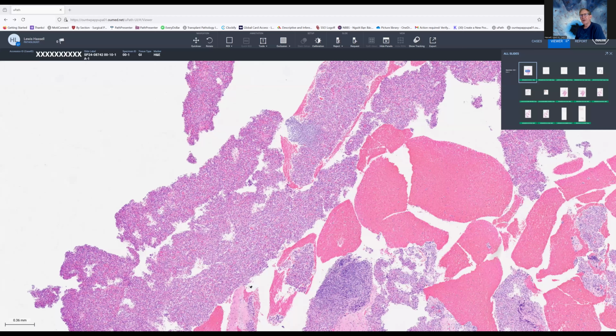Now, of course, it can be quite disconcerting when you get that biopsy expecting to see hepatic fibrosis, nodularity, and so forth, and instead you just see this very seemingly monotonous array of tissue that does not look anywhere near similar to normal hepatic parenchyma. So here you can see the low power.